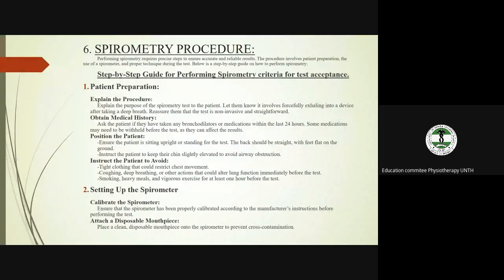If that will obstruct the airway during spirometry, you tell the patient to undo any tight clothing that could restrict chest movement. Avoid coughing, deep breathing, and other actions that could alter lung function immediately before the test. Avoid even smoking, heavy meals, and vigorous exercise for at least 1 hour before the test. You tell the patient to rest before the test.